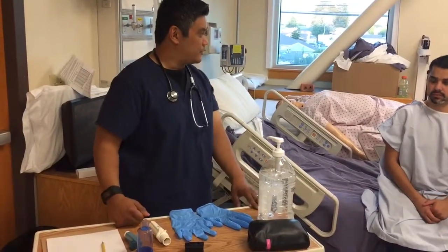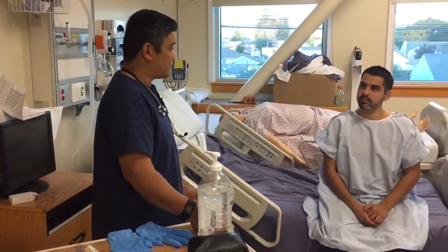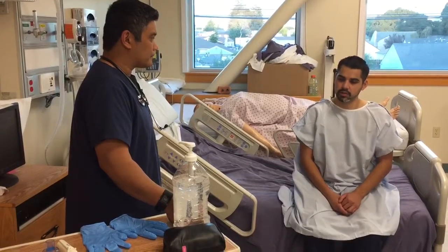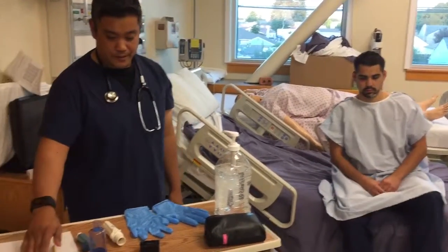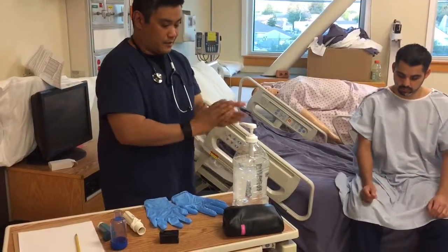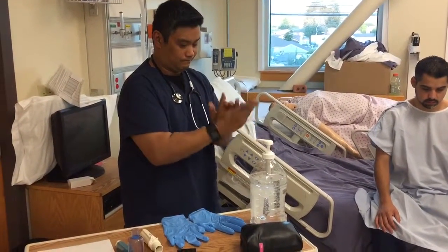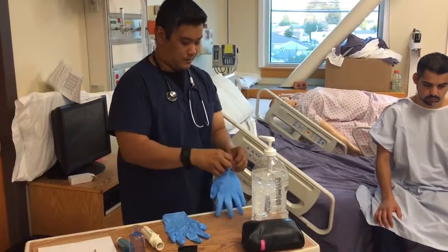Hello, how you doing? My name is Richard, and I'm a student at the respiratory care program at Hartnell. I'm here to do a treatment for you. First off, may I have your name and date of birth? Christian Galvin, 5/25/1990. All right, now I check the chart just to be sure, and that's correct. And I'll go ahead and put on hand sanitizer and the gloves.